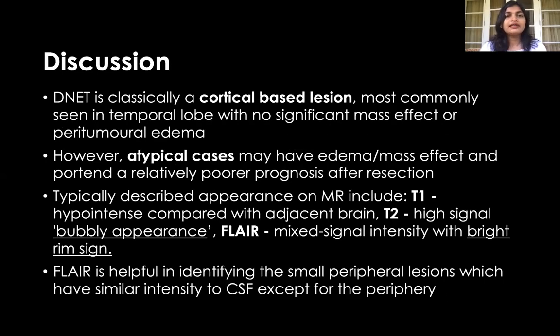Discussion. DNET is classically a cortical-based lesion, most commonly seen in the temporal lobe with no significant mass effect or peritumoral edema. However, atypical cases may have edema or mass effect and portend a relatively poorer prognosis after resection.